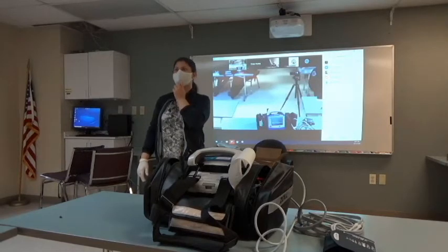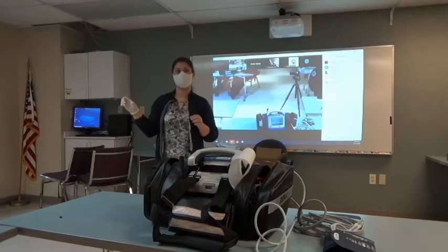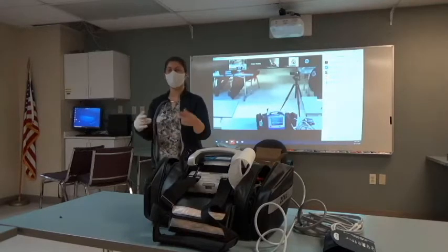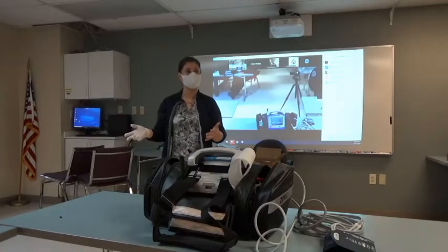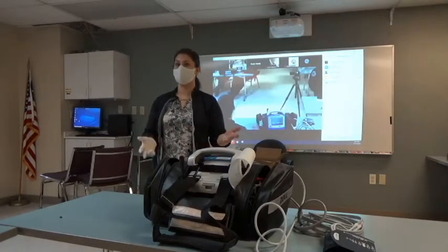Yep. It does have a self-purging feature on the device as well, so if it senses something's coming close to that filter line, it will reverse the pump to try to clear it. If it can, great, it goes back to monitoring your patient. If it cannot, it's going to say that it's occluded. We're going to replace it at that time.